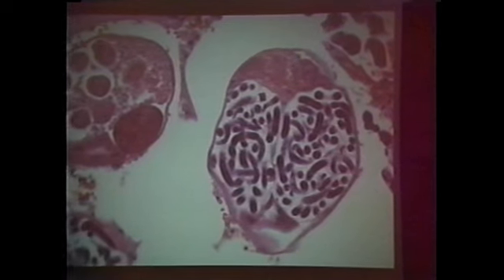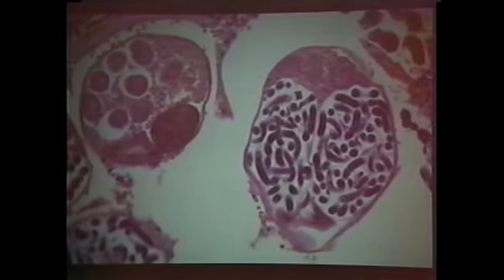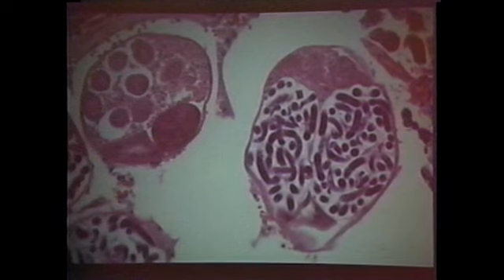And while we're talking about sex, let's talk about eggs, ova, and sperm. There are 2 things that make me nervous as a parasitologist, and my residents will tell you that. That's the use of the word ova. It's not your fault, people started this a long time ago. If there is something that doesn't have a shell, it is an ova.